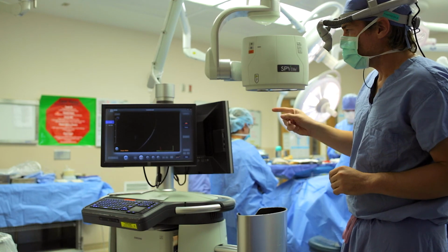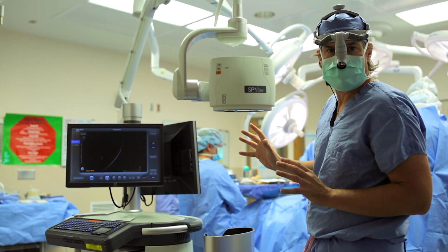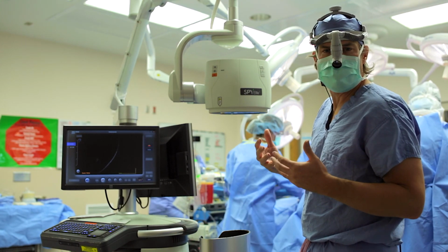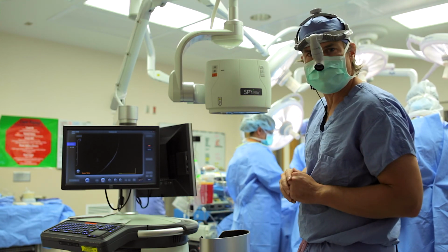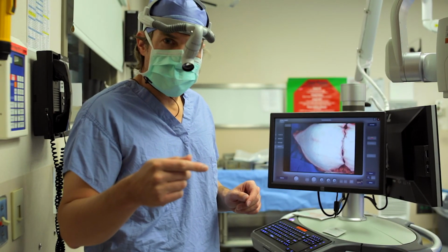We're going to look at some stuff on the screen now, images that we've already obtained, and use the SPY and the SpyQ software to do some analysis of what we've already obtained as far as images. A little bit later, we'll shoot a SPY image on this patient here. So we're going to review an image that we took the other day.